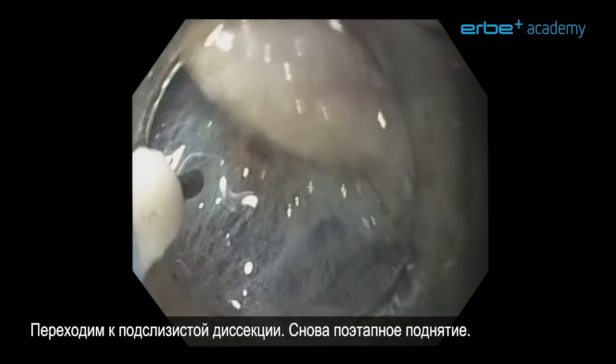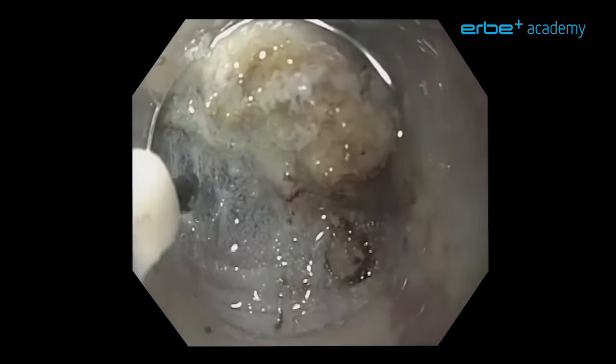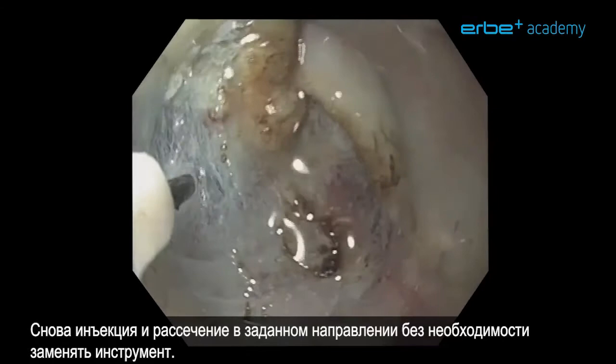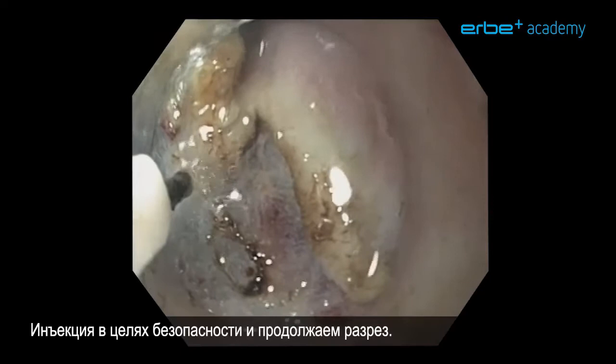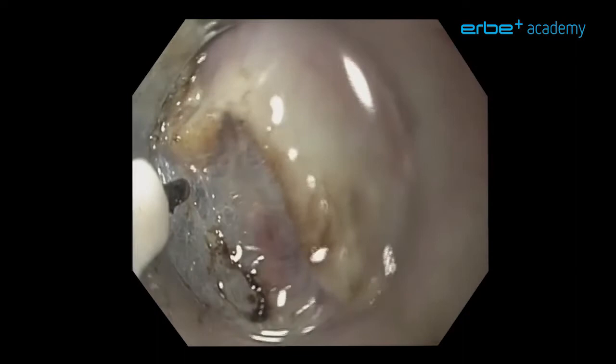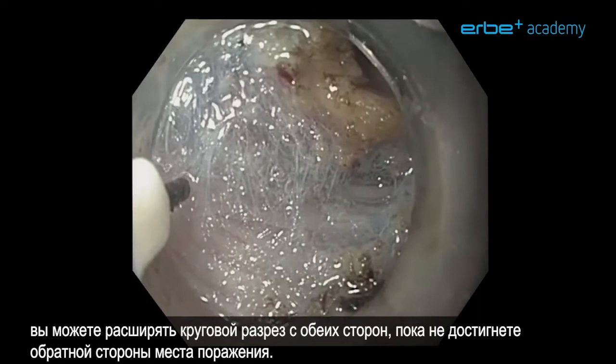Here you can see we are making this partially circumferential incision. We move to the submucosal dissection — again, stepwise lifting. We appreciate the muscle layer and start cutting very slowly, taking out all these separate fibers. Inject and cut in the pre-decided direction without having to exchange the instrument. Injection for safety and continue the cut. When you have done the submucosal dissection up to the level of the circumferential incision, you can extend the circumferential incision from both sides until you've really reached the back side of the lesion.